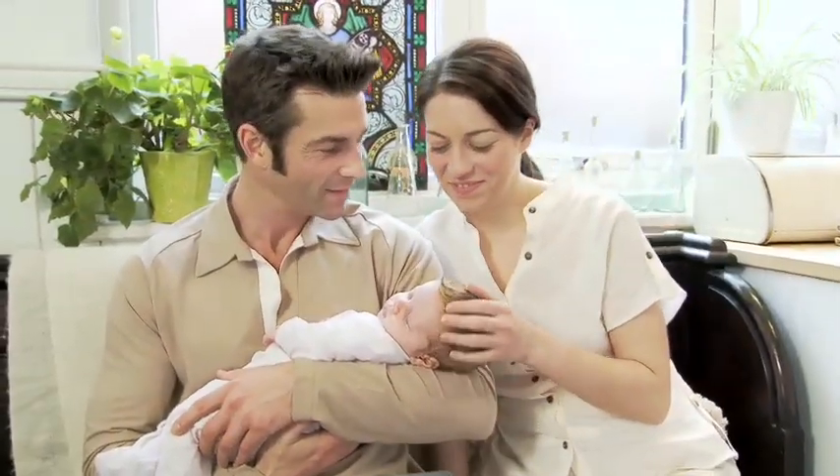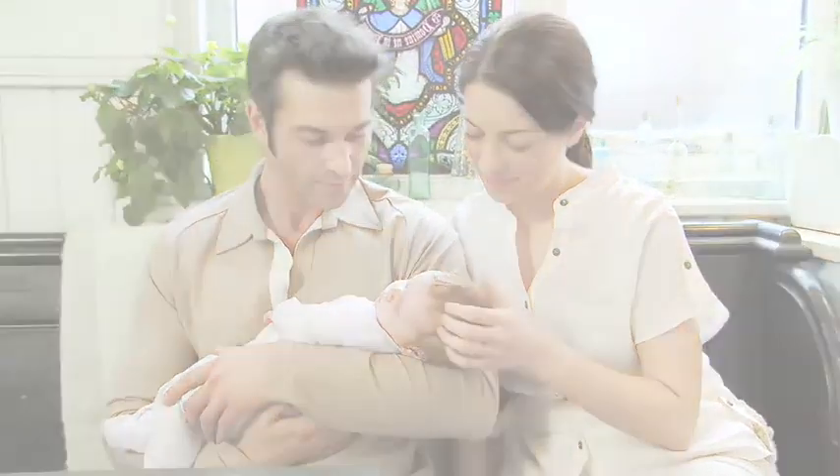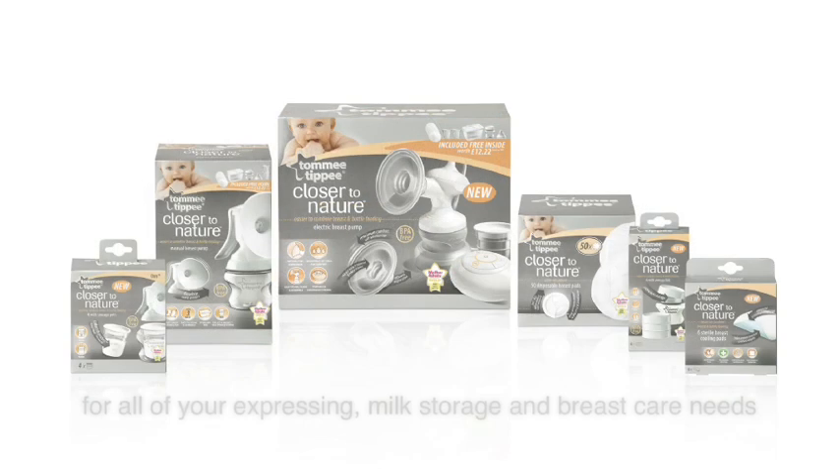For busy mothers who want to breastfeed for longer, Tommy Tippy's electric breast pump is the ideal partner. It gives mums the freedom to express anywhere, at any time, which means that a baby can continue to enjoy all of the nutritional benefits of breast milk, even when mum isn't there.